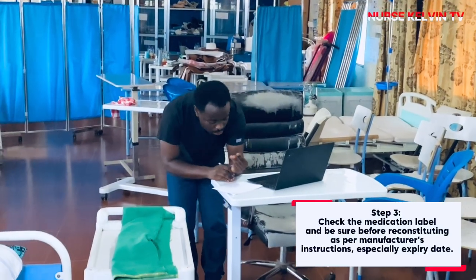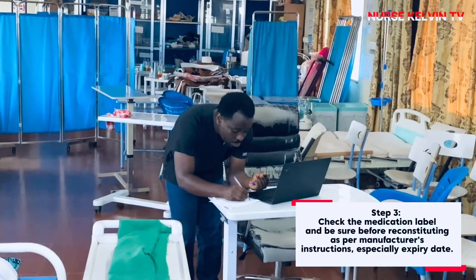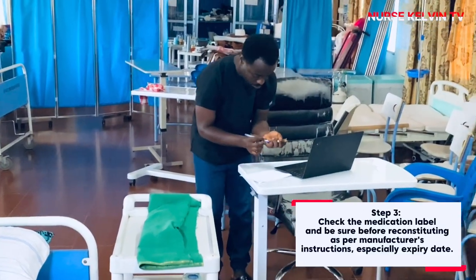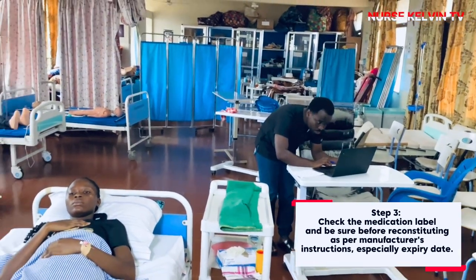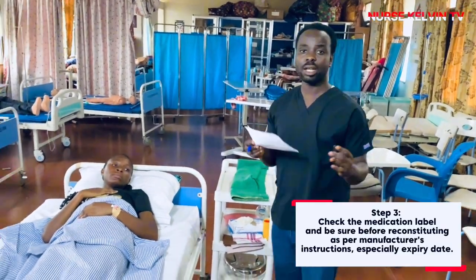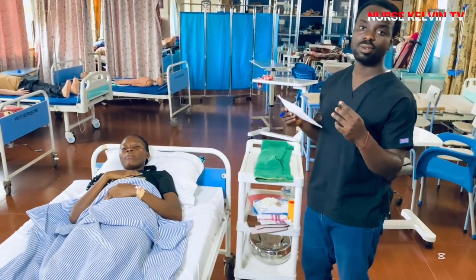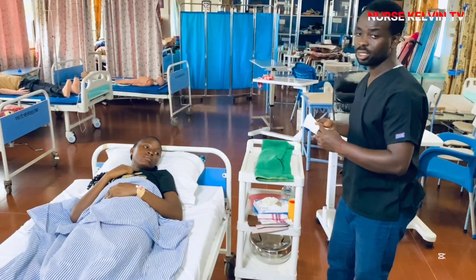Then you check the expiry date. Check the right time. Okay guys, my check is right patient, right medication, right time, then the expiry date and the drug name.